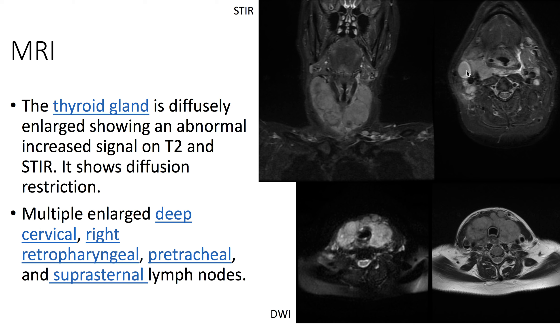This is the patient's PET-CT. We see an FDG-avid diffusely enlarged thyroid gland with an SUV max of 15.